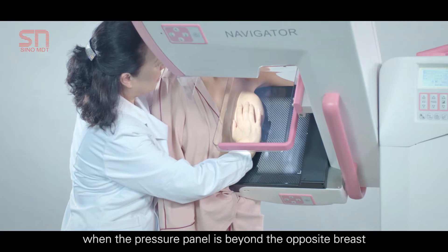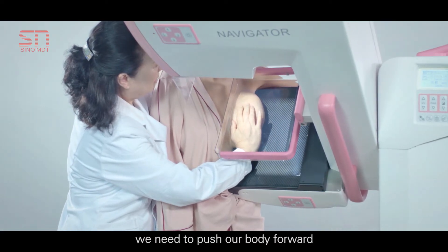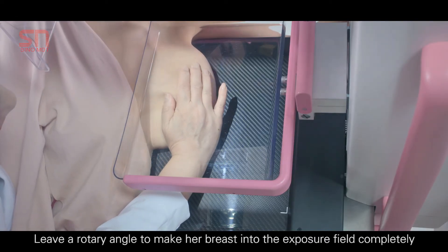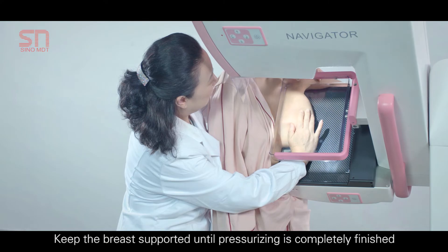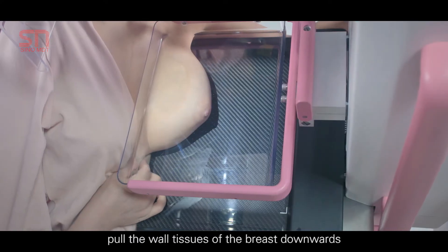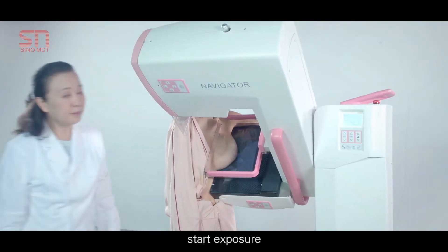When the pressure panel is beyond the opposite breast, we need to push our body forward, leaving a rotary angle to make her breast completely into the exposure field. Keep the breast supported until pressurizing is completely finished. Pull the wall tissues of the breast downwards to spread the lower ruga of breast. Start exposure.